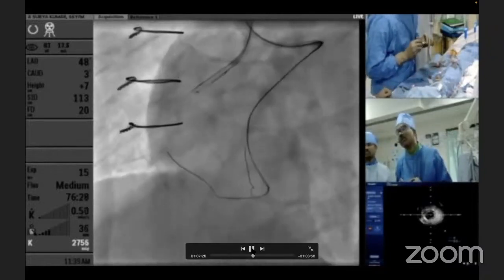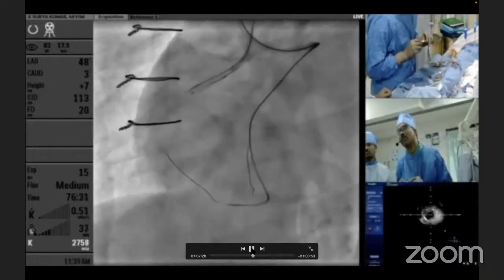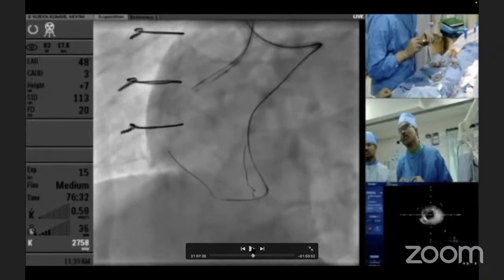See, it's not yet sure that you are in the true lumen distally. We don't know. I mean, this wire is not in true lumen. My plan is to see here, basically, there is a bifurcation. CTO is extending up to the bifurcation. So primarily, the safest strategy, if you want to save all the branches, is externalization, because that saves all the branches rather than conflicting with antegrade wiring.